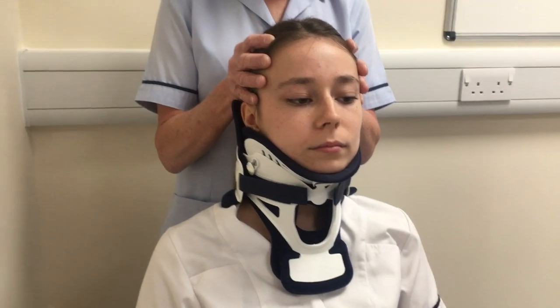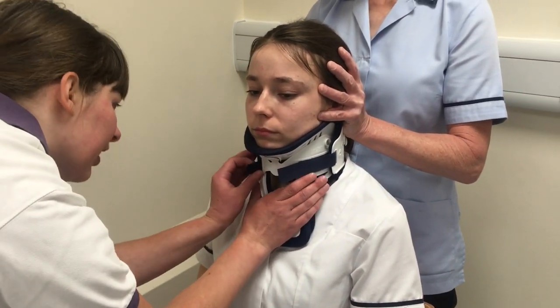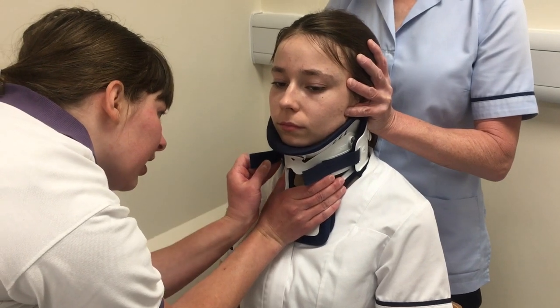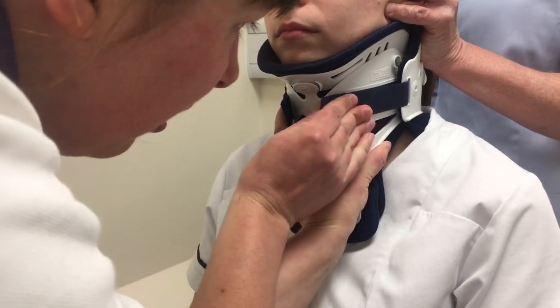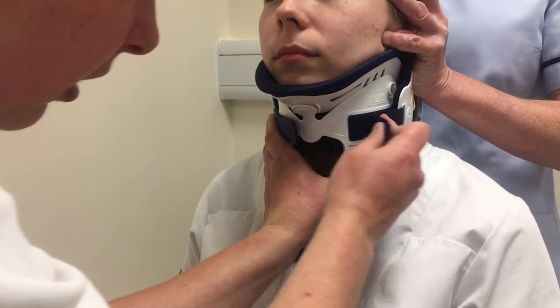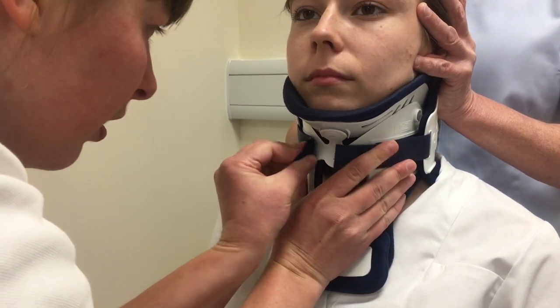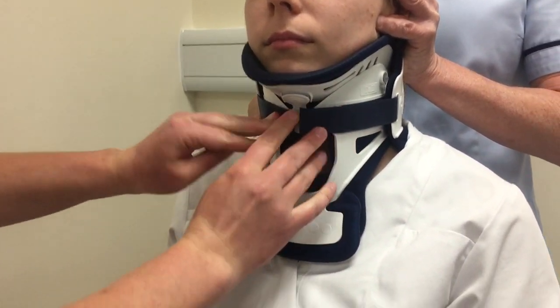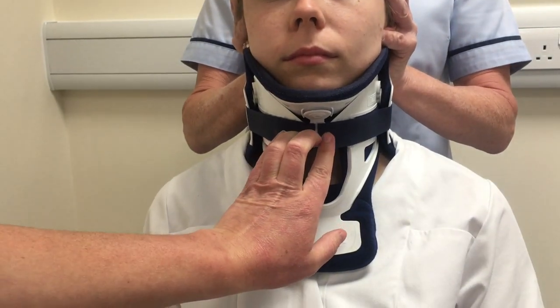Then we're ready to adjust — around the front, with some pressure on the back, patting it over and scooping up. Check that the collar comes up even on each side.